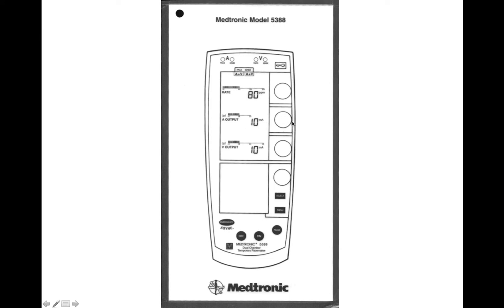The adjustment for your atrial milliamps defaults right beside the rate knob — that's the knob right here. And for your ventricular milliamps, that's just to the right of that as well. There's also a menu select button right here, which will get you to the different mode settings and adjustments for your sensitivity.